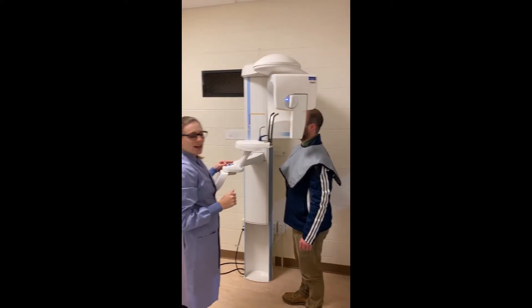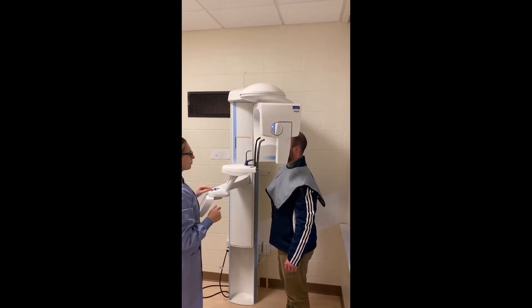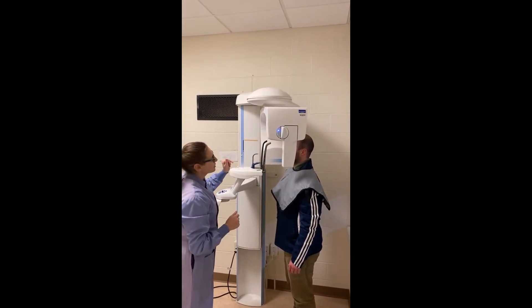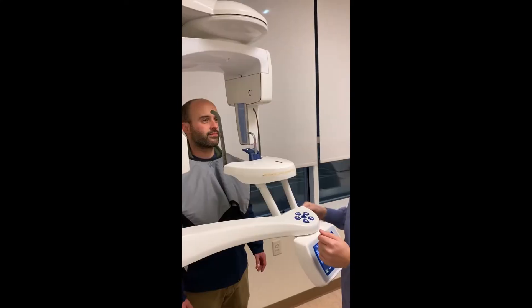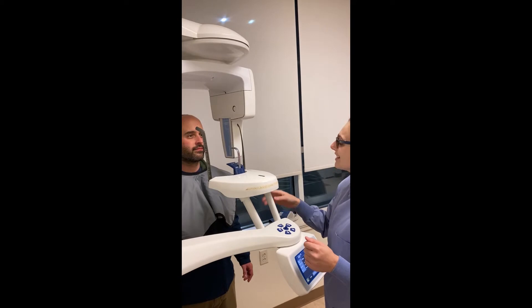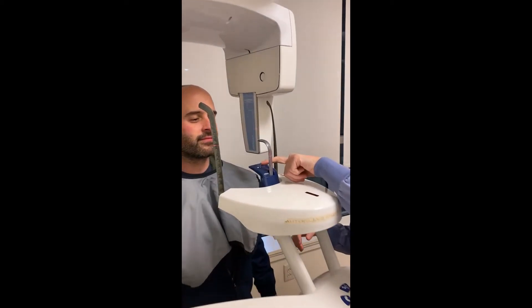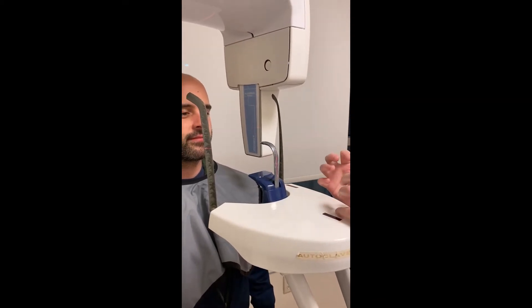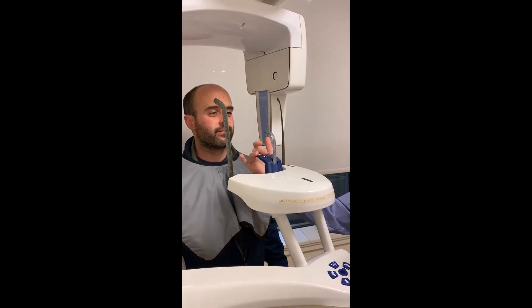Go ahead and lower the machine and describe to the patient what you'd like them to do. Once your patient is in the pan machine, have the bite stick positioned higher than the chin rest so the patient doesn't feel claustrophobic coming in and doesn't hit their chin on the chin rest.